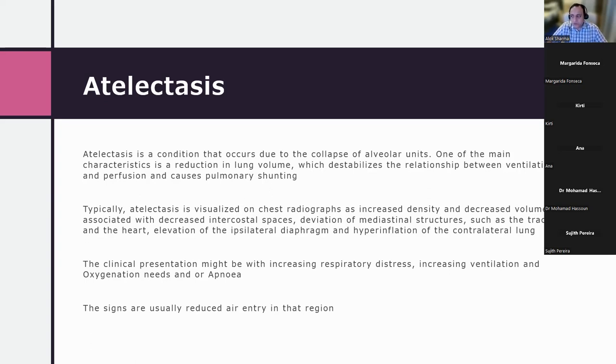which creates a lot of confusion, and people are trying to diagnose whether this is atelectasis or collapse. And for me, the take-home message from all of this is, do not get too fixated on trying to determine that, because it can be incredibly difficult. What's important is clinically correlating, looking at your clinical findings. And the most important other aspect is doing a full comprehensive scan of all the regions, where clinically possible, where the baby's stable, to then make an overall diagnosis.